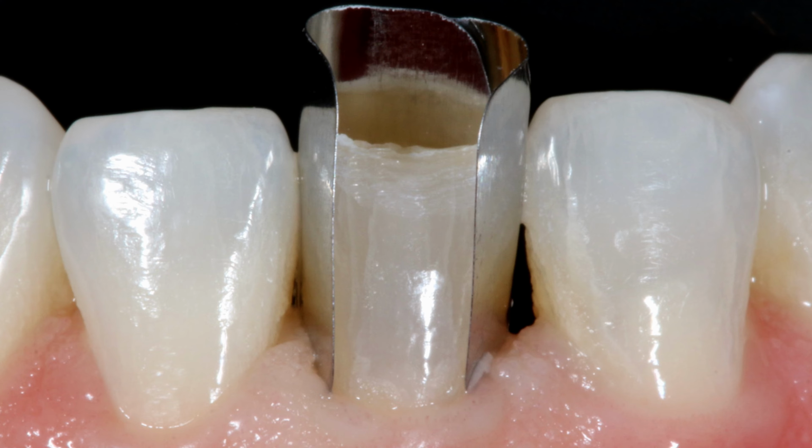Initially I put a matrix band in because in my mind I was thinking, okay, I need to restore the mesial first or the distal first, and then once I get that taken care of, I'll restore the other side. That's the way I had done it in the past with the clear strips, because I found it was a hassle to restore both sides at once by wrapping the band around the tooth, like a mylar strip. But once I put that in, I thought maybe I can overlap this and put a second band on here to help contour both sides at the same time, and that's what I ended up doing. You can see this would not work if the tooth was so skinny, unless you trimmed the band, which is probably what I would do. I would just trim that band and it would still work.